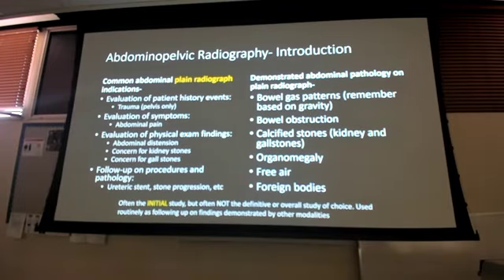But here we go. So, in general, plain radiograph indications. Look at that. Everything. Trauma, pelvis only typically, because we're looking for that unstable pelvis, like we talked about. Make sure, is it stable, is it not stable? Any type of abdominal pain, people are going to get an x-ray.